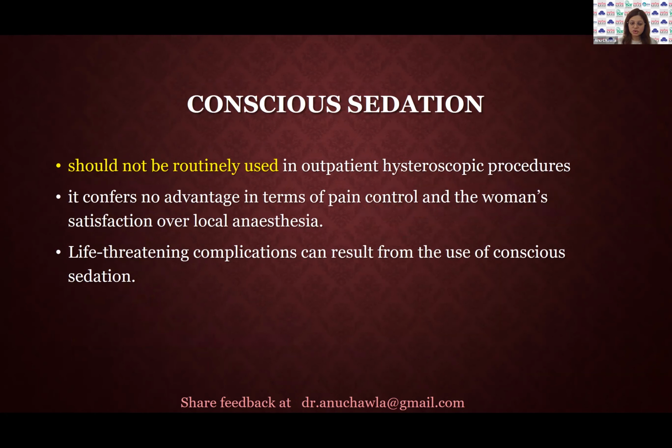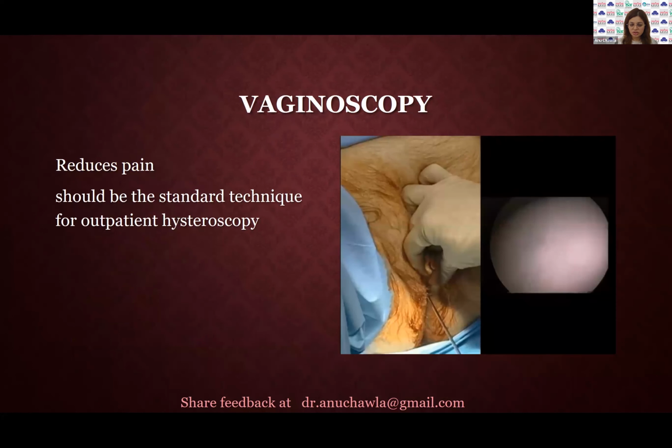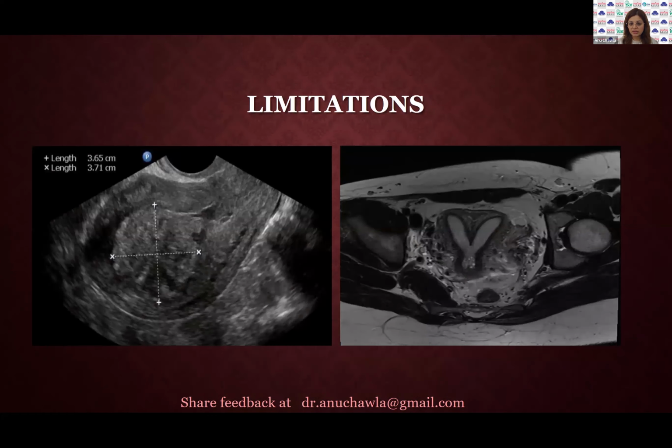Conscious sedation should not be routinely used. Vaginoscopy should be used, especially when you occlude the labia. It helps and aids the scope to enter the cervix without you actually putting the speculum inside. Now, here we complete the guideline summary, and then we do some other discussion.